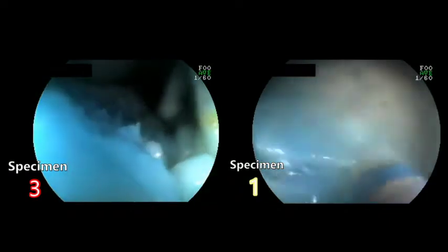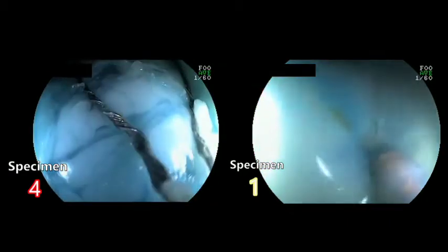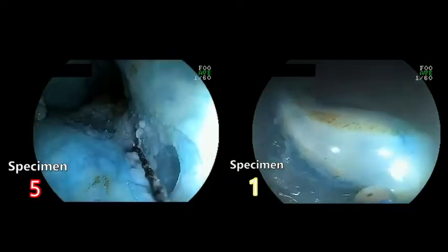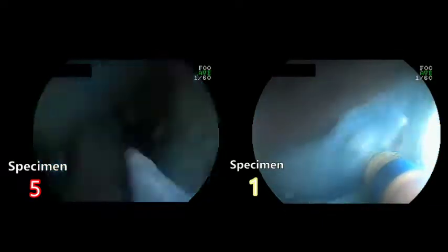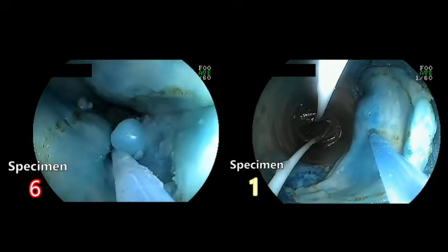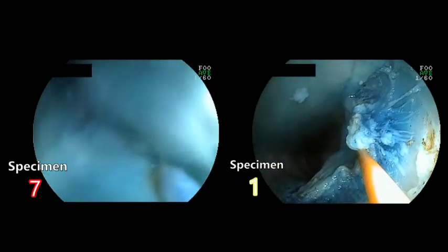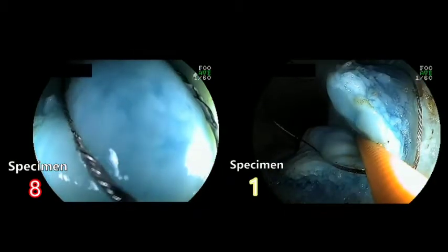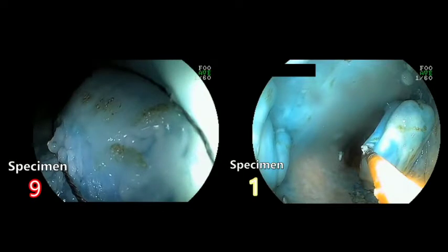In the double balloon hybrid technique, first of all a circumferential incision is performed in order to free up the margins. Once the margins are complete, the borders are further demarcated to ensure that it's freed up. Upon ensuring that the borders are freed up, the middle of the lesion is injected with submucosal injection fluid. After this, the endoscope is removed, the snare is placed on the outside of the endoscope, and the biopsy forceps can then be used to grasp the lesion and lift it into the lumen.